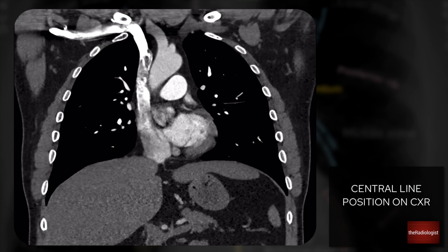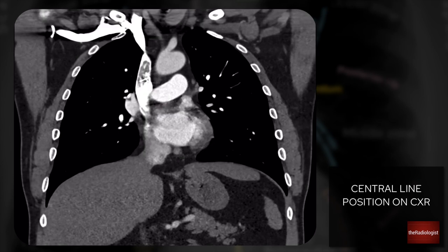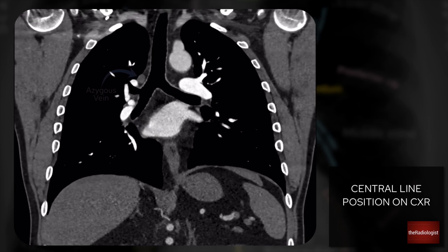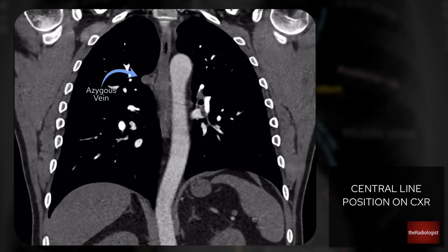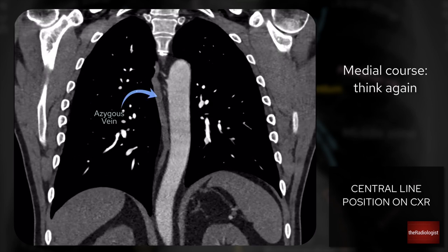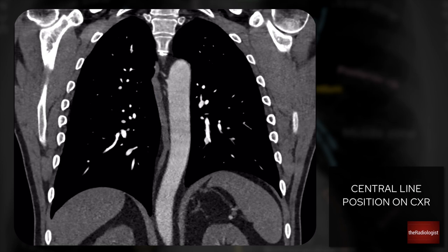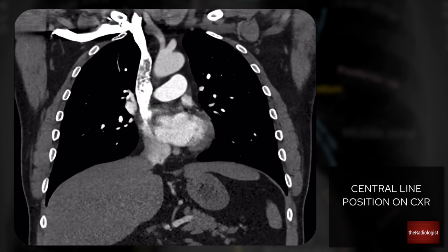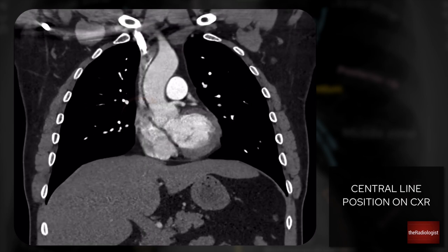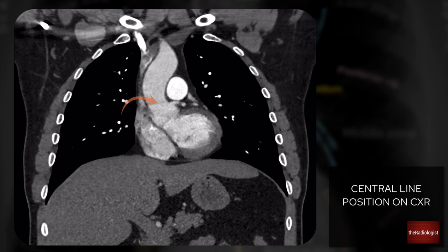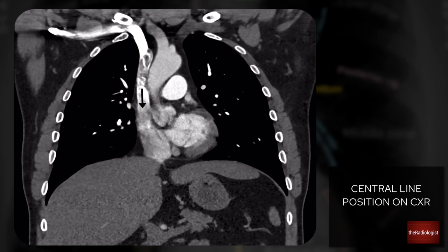Where don't we want the line? First, the azygos vein, which runs up the posterior mediastinum and drains into the SVC. On CT we can see it as a small circle just above the right main bronchus, heading medially towards the posterior mediastinum. If the line courses medially after what seemed a normal course, it could be in the azygos vein — that would be a malpositioned catheter. The second place to avoid is within an artery. If the line enters via the subclavian artery by mistake, it will end up in the aorta, heading more medially towards the aortic root rather than taking the expected vertical course on the right side of the mediastinum.